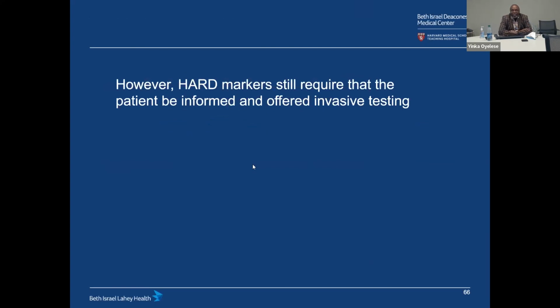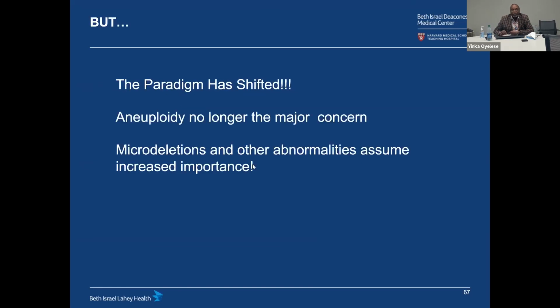However, hard markers, the heart defects, the brain abnormalities, the other abnormalities still require that the patient be informed and offered invasive testing. But these soft markers, which are normal findings, should not lead to worry of the patient, of the physician, or to us offering invasive testing. And as I have shown, the guidelines from the SMFM and from ACOG all say do not offer invasive testing for these, and for the most part do not follow up with ultrasound because these are normal findings.